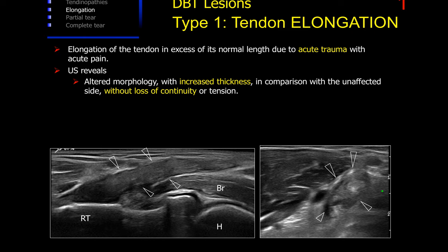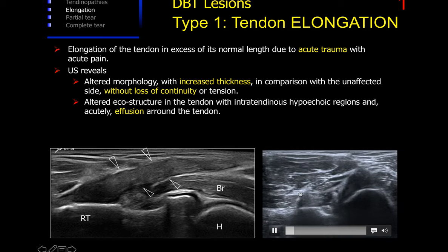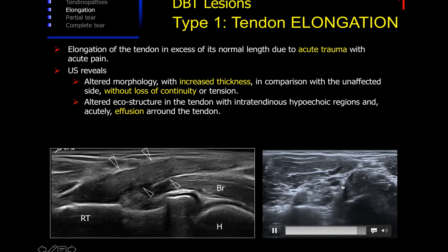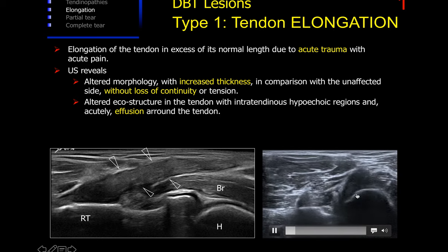Type 1 injuries are the least severe form of injury — a tendon elongation just beyond the elastic capacity of the tendon. Ultrasound shows an increased tendon thickness. We can see the thickness of the tendon is clearly enlarged in comparison with the unaffected side, but without loss of continuity. We see continuity in the attachment from the tendon to the radial tuberosity, and we find an altered echostructure with hypoechoic regions and effusion in and surrounding the tendon.